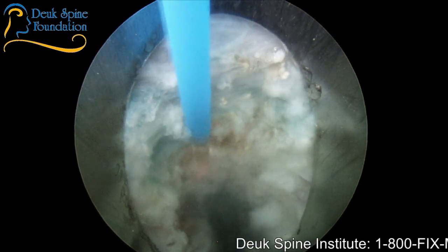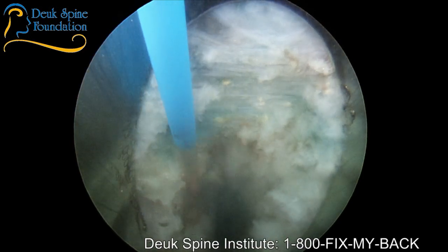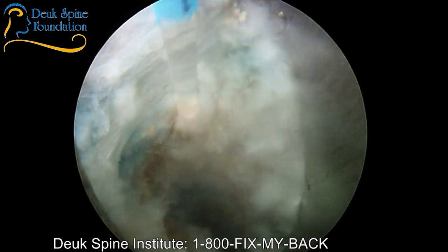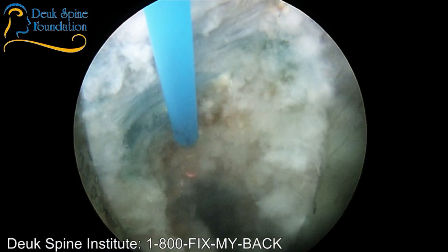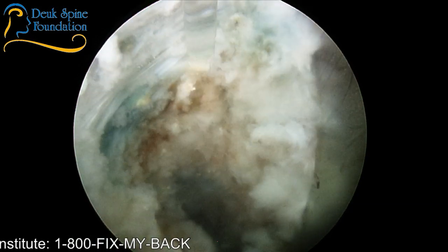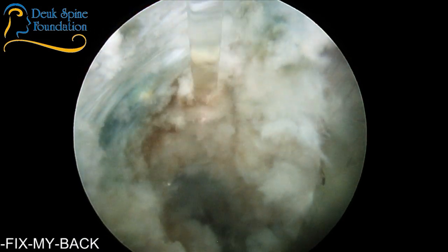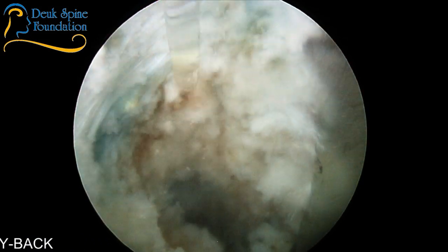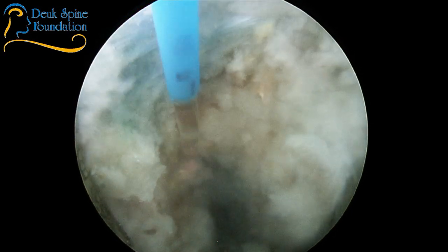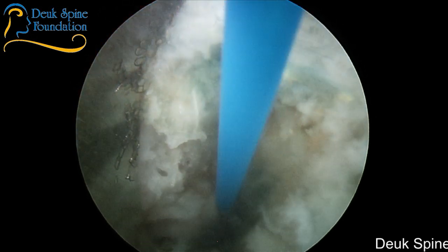So guide wire-based surgery has really blossomed over the last 30 years, where a surgeon will put in a wire under X-ray control, or some other form, CT now, and then they'll put tools down the wire, guiding by the wire. So the wire guides the tools to the right place without making a big skin incision. So it's part of the minimally invasive spine surgery technique to use guide wires.